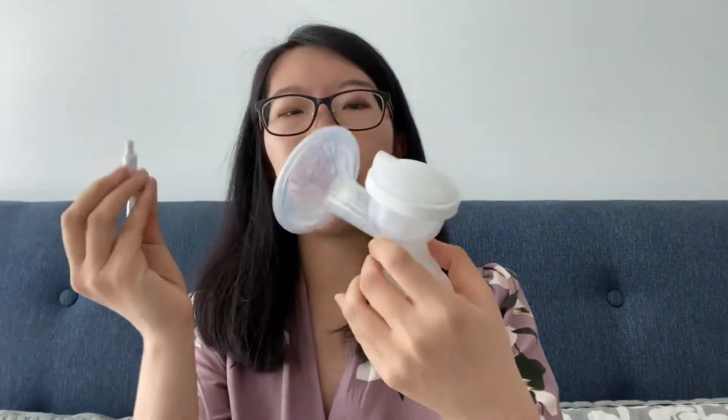You just take the pump and connect it with the tube that it comes with. The white part goes directly into this hole, and then you can pump. This part you can turn into a double pump or a single pump.